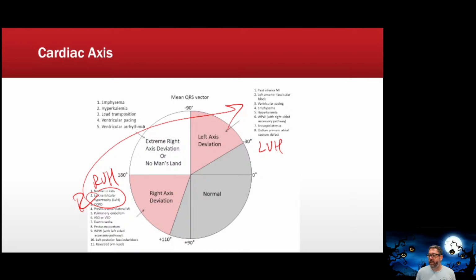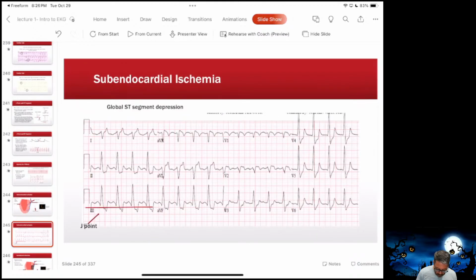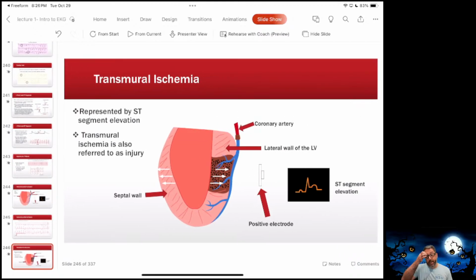No, like what's considered tachy, what's considered brady, what are the rates for that? And remember, all of the answers are going to be on the paper in front of you. If you don't know what rhythm it is, look at the answers.